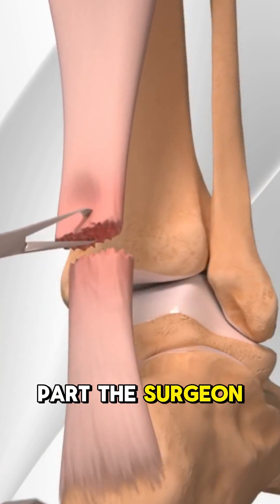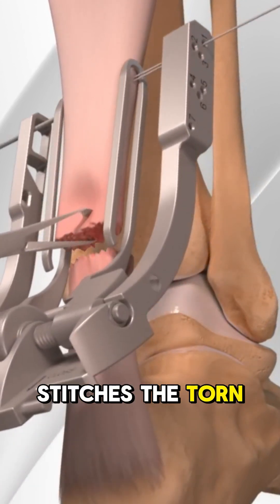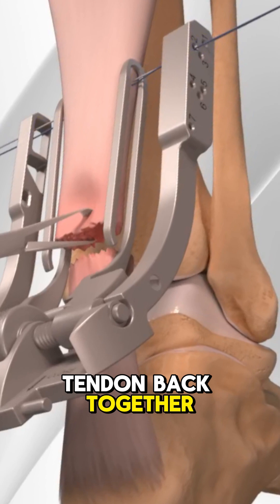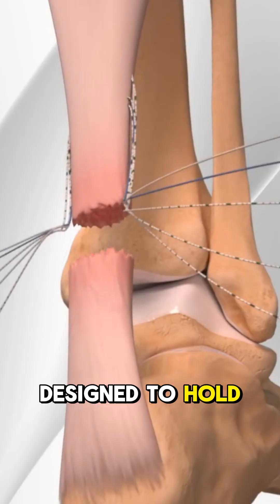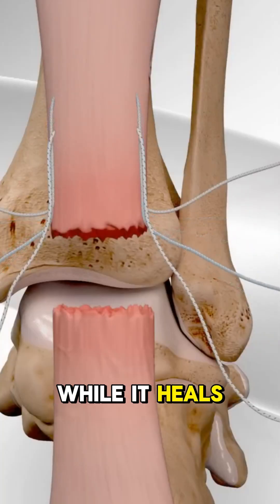Here's the cool part. The surgeon carefully stitches the torn ends of the tendon back together using strong, durable sutures. These sutures are designed to hold the tendon in place while it heals naturally.